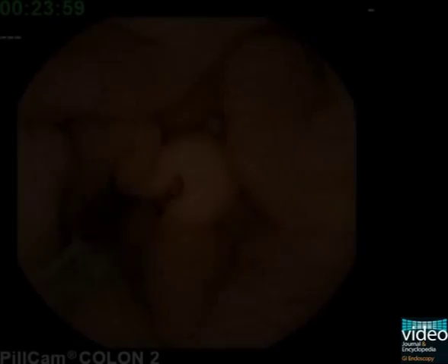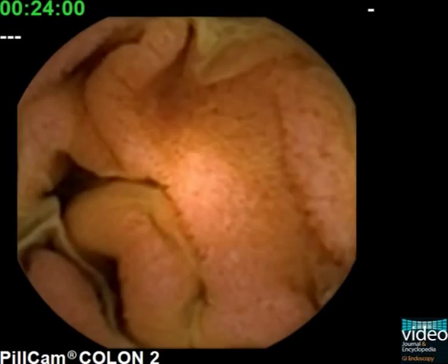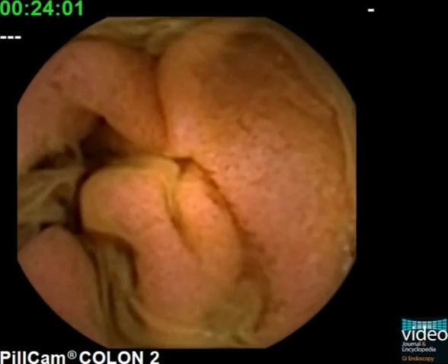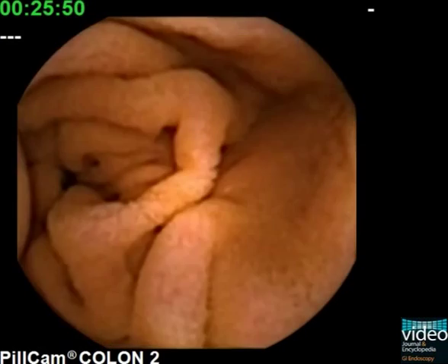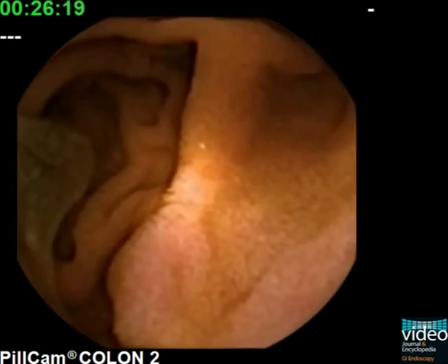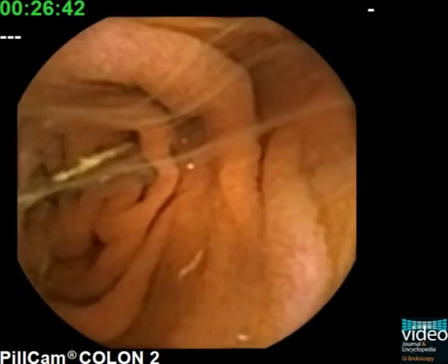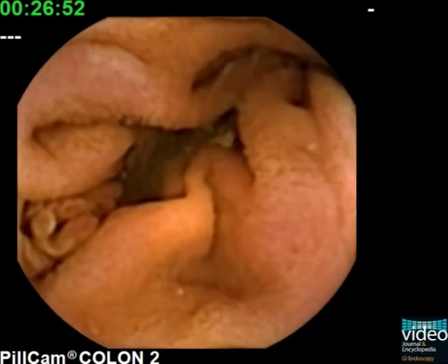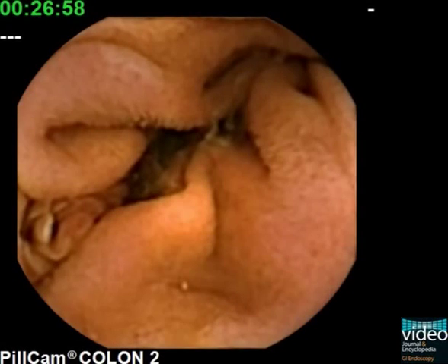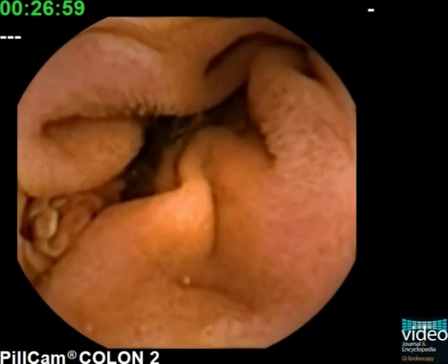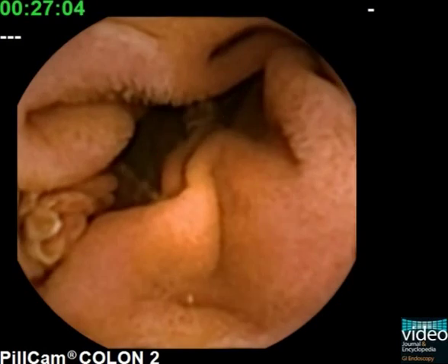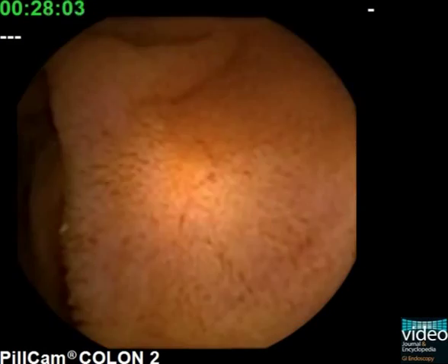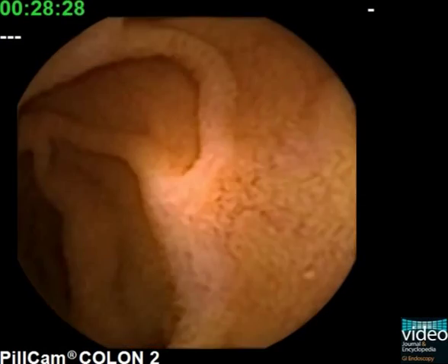A colon capsule endoscope may offer the advantage of two camera heads, and the papilla of Vater is routinely detected by one of the two cameras. It may be seen at 8 o'clock in this colon capsule video, with opening and closing of the biliary orifice at the papilla.